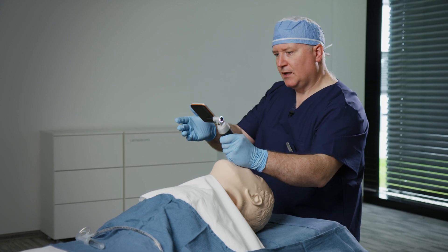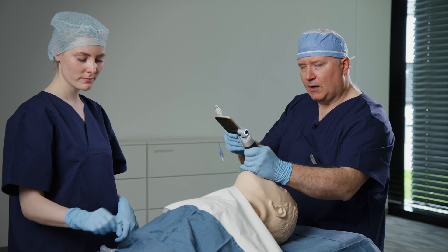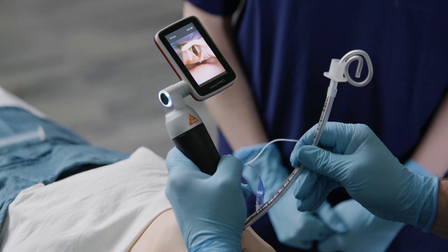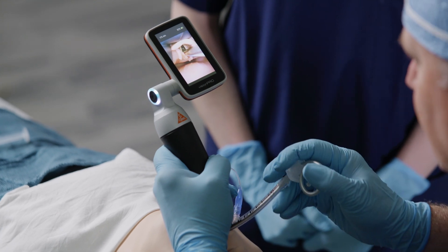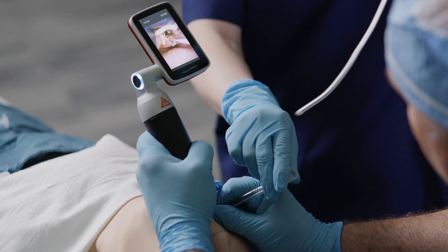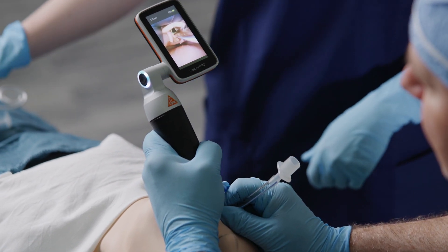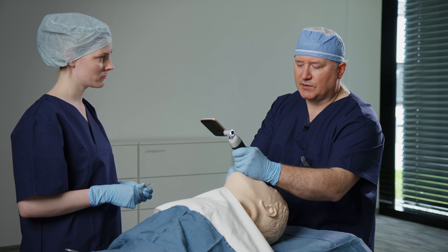I'll ask my assistant to go ahead and hand me the tracheal tube. I have ample room now for tracheal tube delivery on the right side of the laryngoscope. It's easy to deliver the tracheal tube under these conditions. Let's go ahead and remove our stylet. This system has illuminated and magnified the hypopharynx in such a manner that this procedure is seamless.